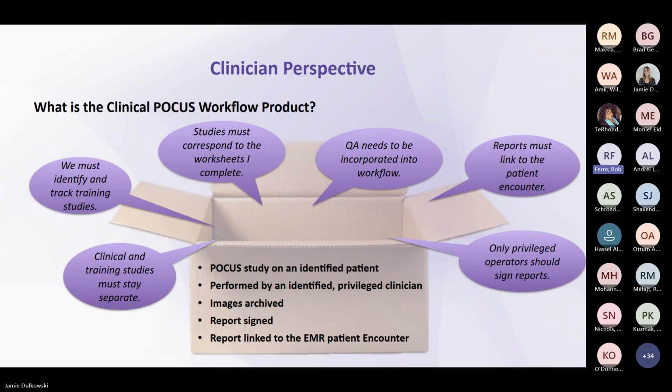After all of the listening that we had done, and having a lot of clinicians on this work group, basically what we said is, what is our POCUS workflow product? Essentially, it's a point-of-care ultrasound study done on an identified patient, performed by a clinician with point-of-care ultrasound privileges, where images are archived, a report is signed, and all of that is viewable in the electronic health record. Next slide.